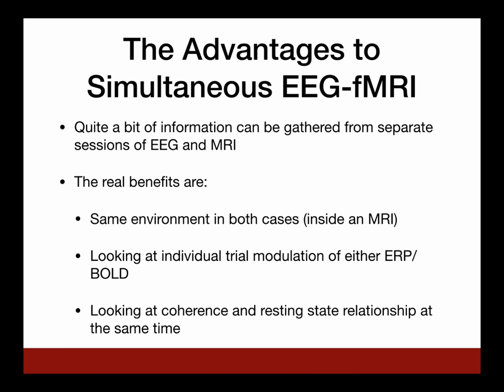You can also look at individual trial modulation of either the ERP or the fMRI BOLD response, and I'll talk about that a little bit, and how this combination of the information can actually give you interesting, better results because they are very closely tied.